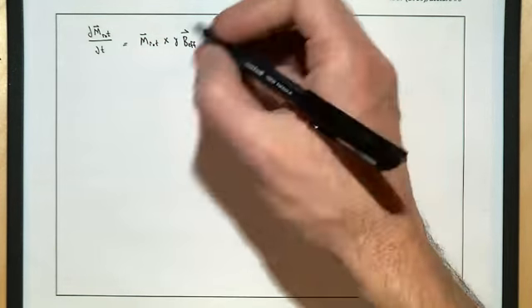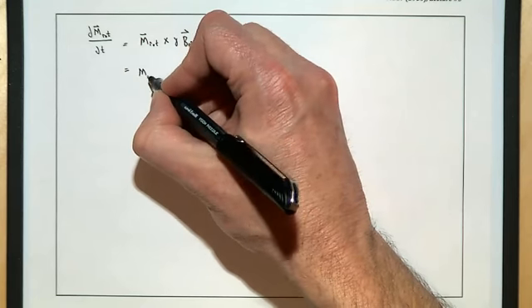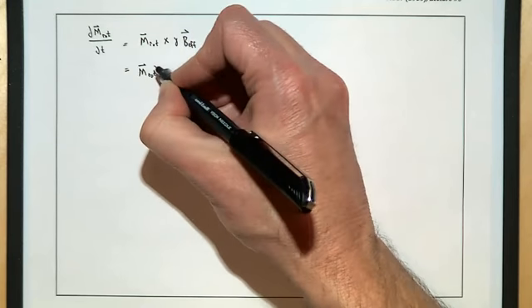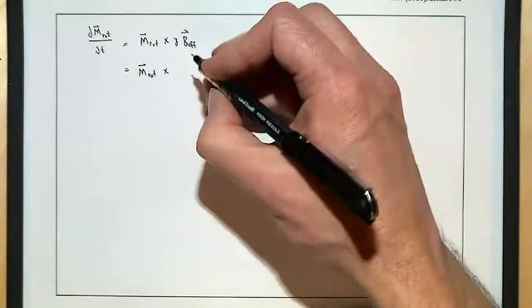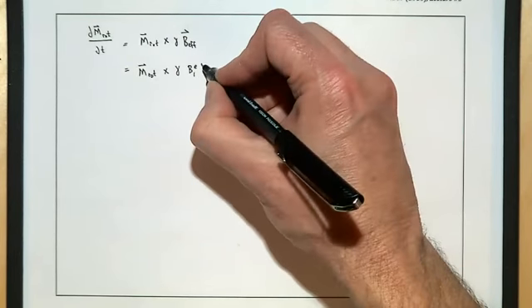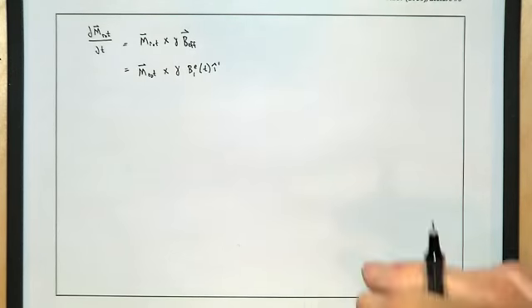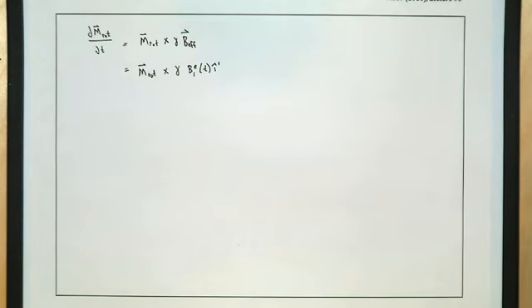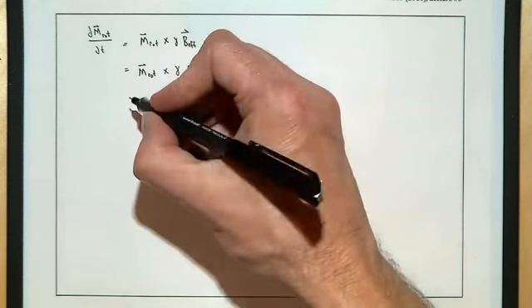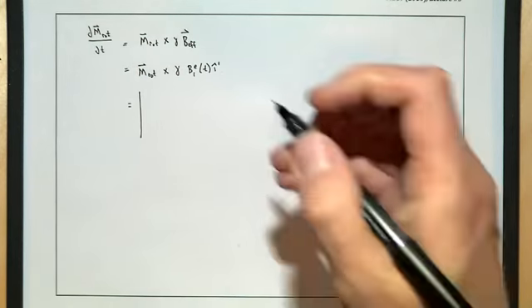We now know the B effective that we want to talk about in this case. So we have M rot crossed with gamma times B1 envelope of T along the I hat prime direction. If we carry out the cross product again, we'll see what kind of system of equations we end up with.